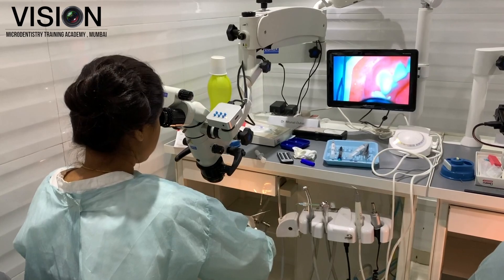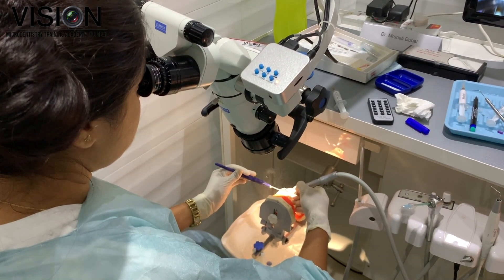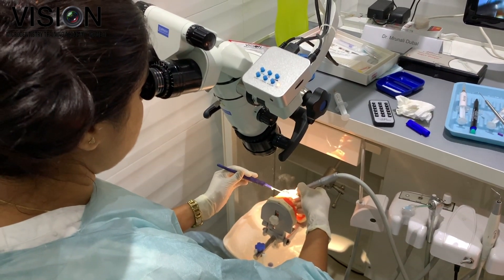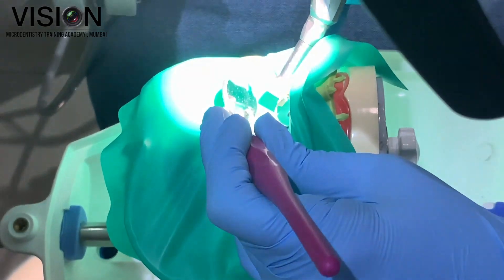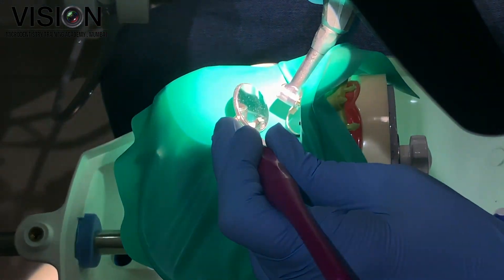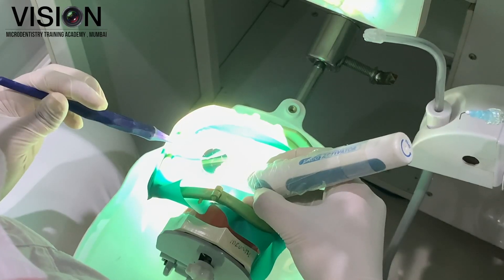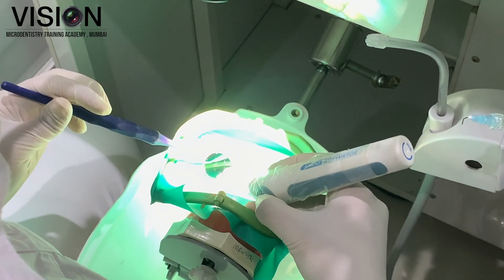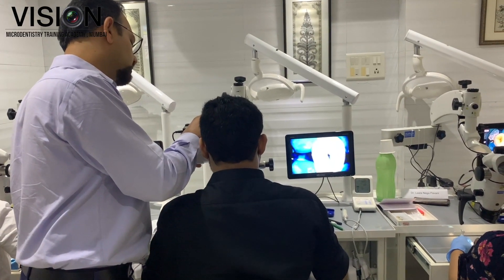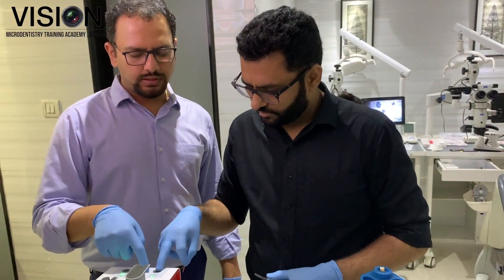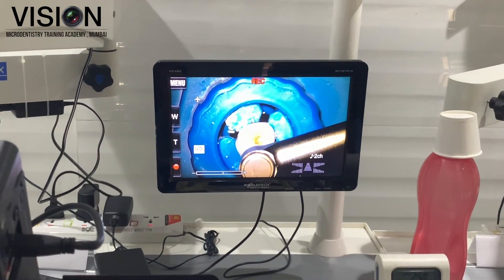The customized workstations for participants are equipped with an airotor and micromotor connection, Stropko irrigators, endomotors, apex locators, activation devices, ultrasonic tips for performing various procedures under the microscope, and devices such as core carrier-based ovens, down pack and backfill devices for warm vertical compaction.